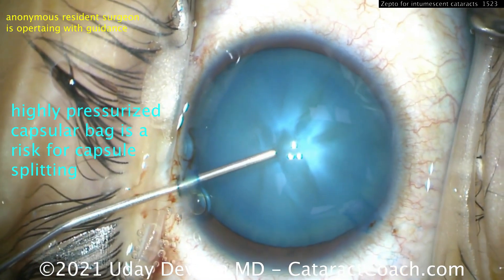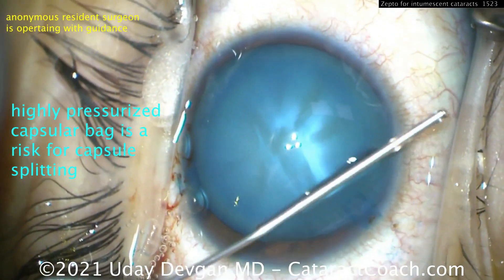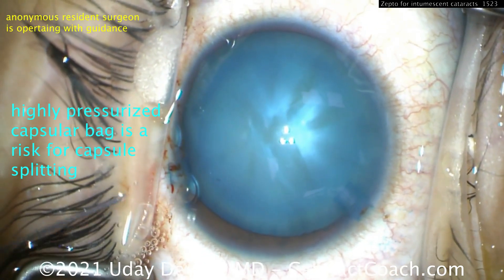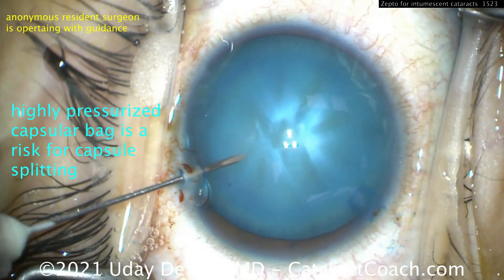Look at this highly pressurized capsular bag. As we fill it up with the viscoelastic and touch the anterior lens capsule, you will notice it is really very pressurized. The bag pressure — intralenticular pressure — is high.